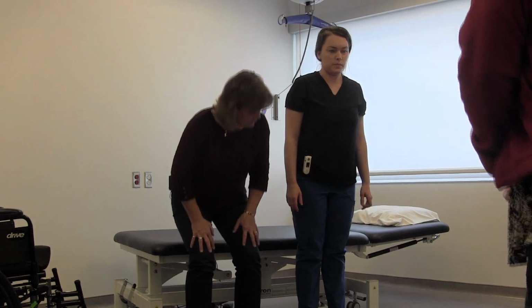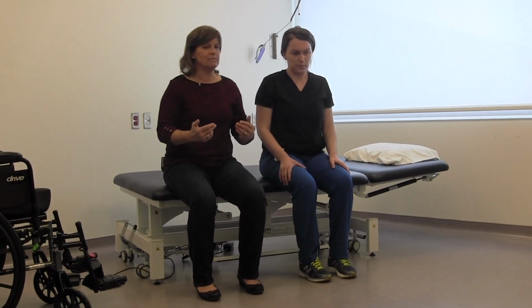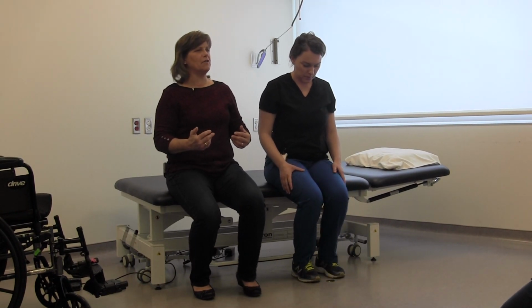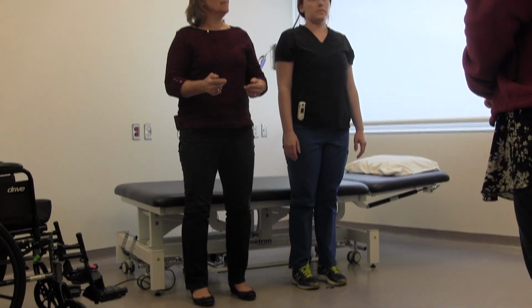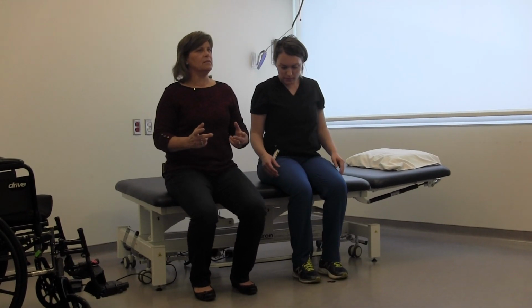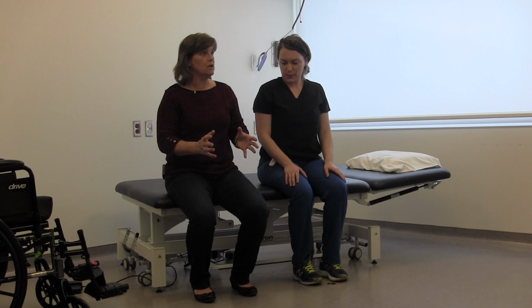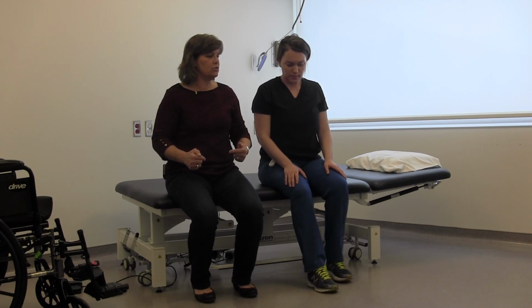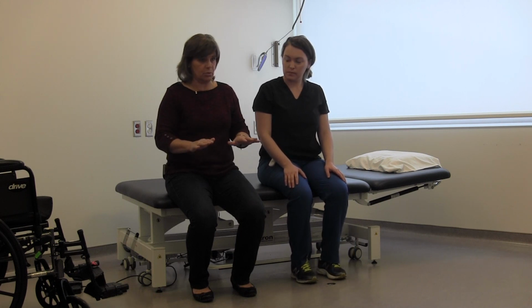Okay? Take a seat. What I want you to do now is come to the edge. Tuck your feet as far back as you can, as long as your heels stay on the ground. Now stand up. A little bit easier, right? A little bit easier, because less weight shift. And we want to make it easy for our clients, we want to make it easy for ourselves. So the rule of thumb that I use in terms of feet, you take those feet as far back as you can, as long as the heels stay on the ground, because you want a good base of support.